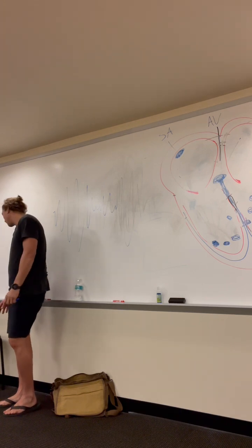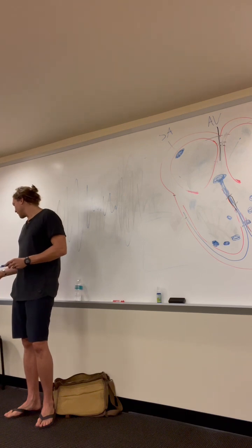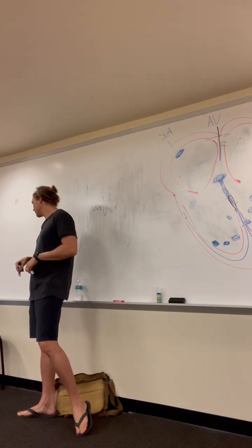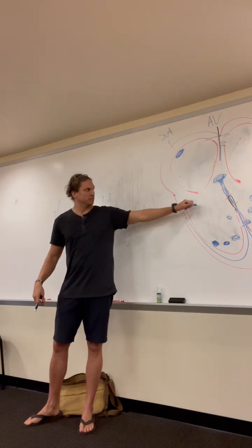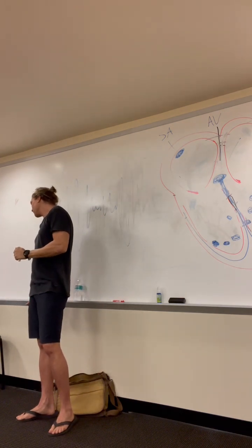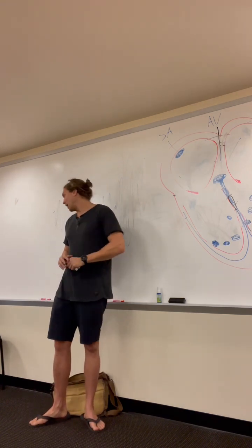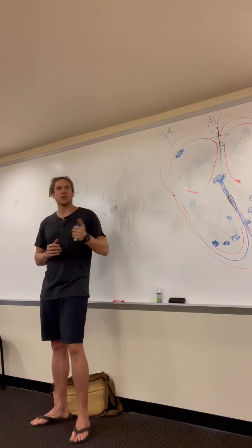Okay, next one, idioventricular rhythm. Let's do the method. Rate looks like it's 30. That's your first hint that it's coming from down in the ventricles. Rhythm, P for every QRS? I don't see any P waves. The QRS is wide. That's my next two hints that it's coming from the ventricles: wide QRS, no P waves. And intervals, I don't have a P wave to judge an interval off of, okay? So your hints here are, it's in that intrinsic 20 to 40 range, and then everything else points towards the bottom of the heart, okay? So you know it's ventricular.